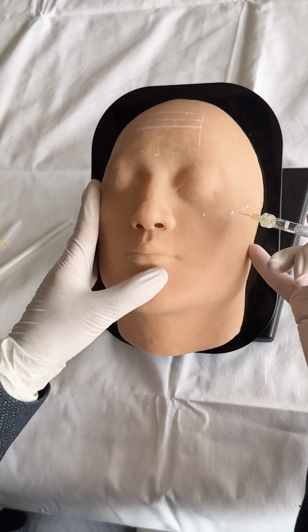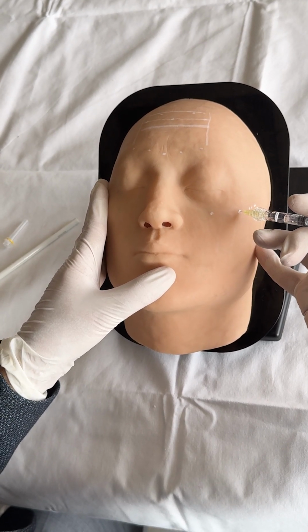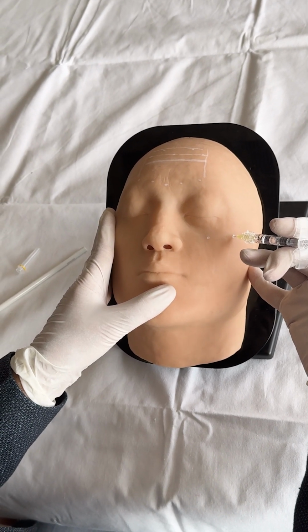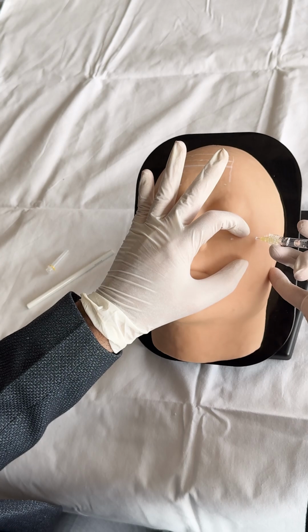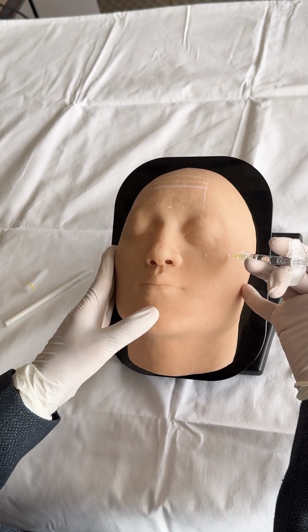The filler needle has to go deep, hit the bone. You will feel a very firm resistance to the needle, which will give you an indication where you have to stop your needle. This will be a similar feeling as you will get while doing the procedure on a real patient. At this point you have to do a slight retraction, thereby injecting the filler into the face.